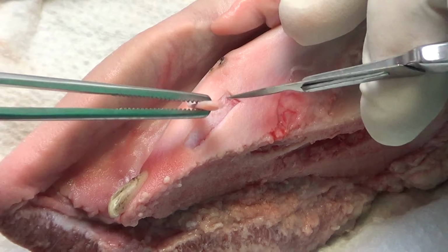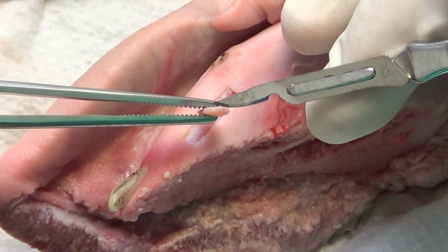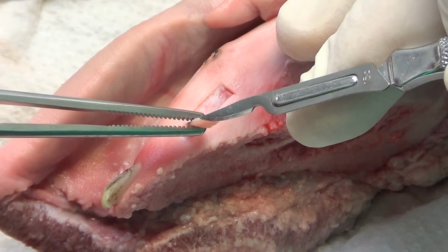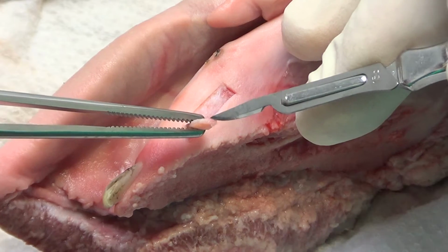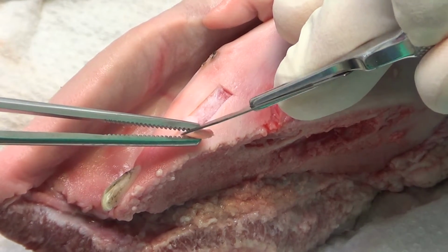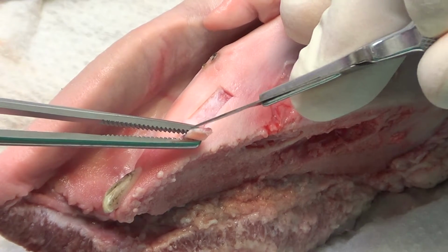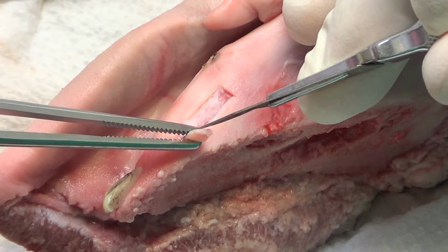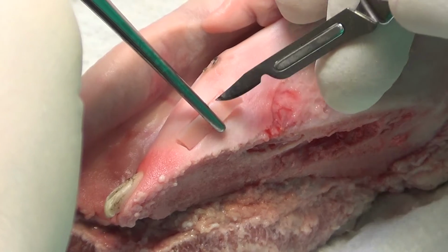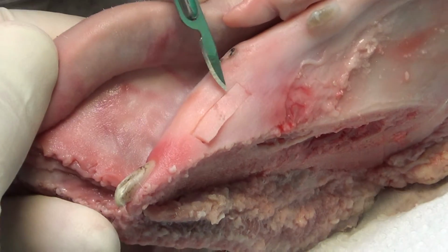Okay, and as you can see, the thickness of the tissue is the same from the beginning, which is coronal, to the end, which is apical. If you find a sort of triangle, which is not correct in terms of thickness, it means that you have modified the direction of the blade.